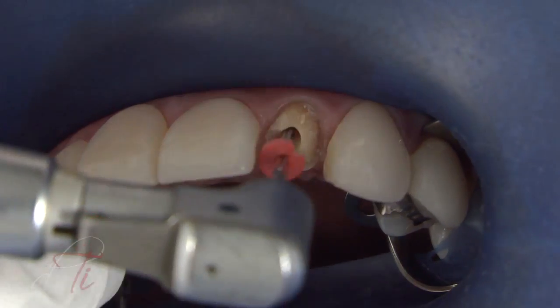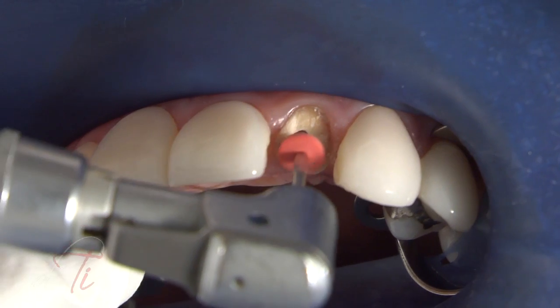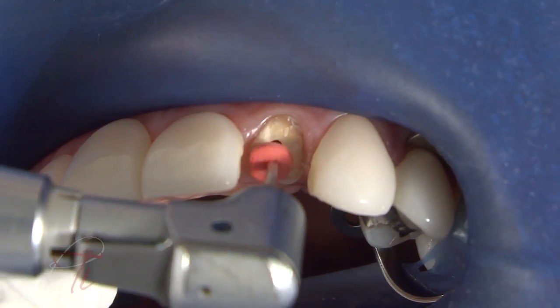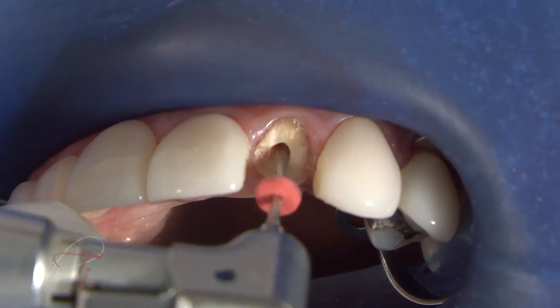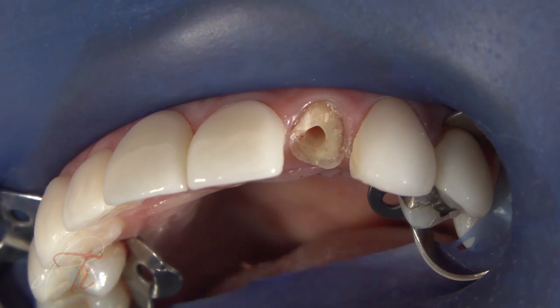The final 1.2mm color-coded drill is used to complete the intra-radicular preparation to the desired coronal diameter and predetermined length, which corresponds to the color-coded 1.2mm Rebuilda glass fiber reinforced post. The completed intra-radicular preparation is now ready.